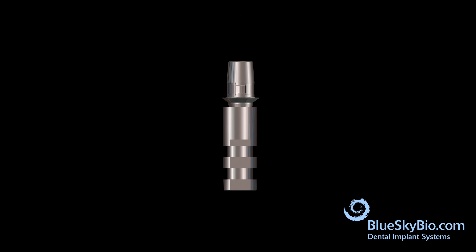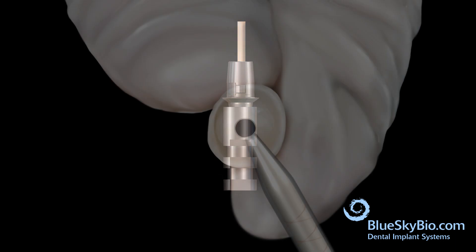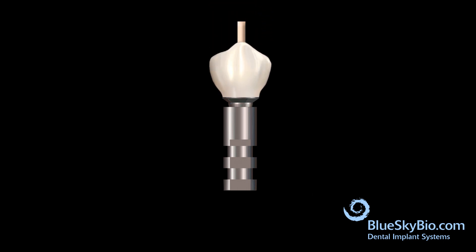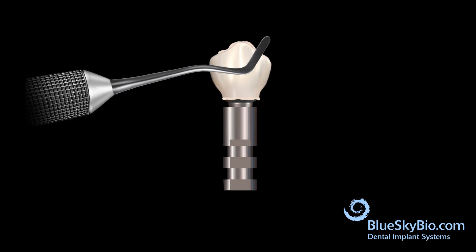Insert the titanium base abutment into an implant analog and screw with light pressure. The wood end of the cotton tip applicator is inserted into the abutment screw channel to keep it protected. Insert bonding material into the crown and bond the crown to the abutment.